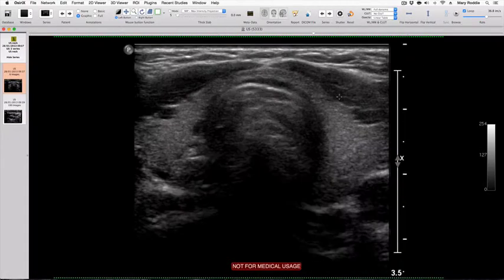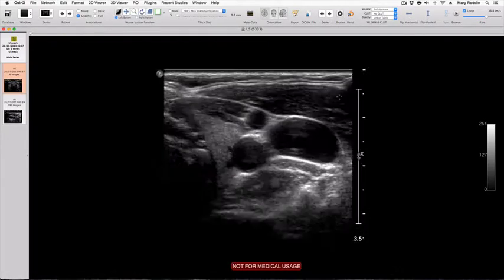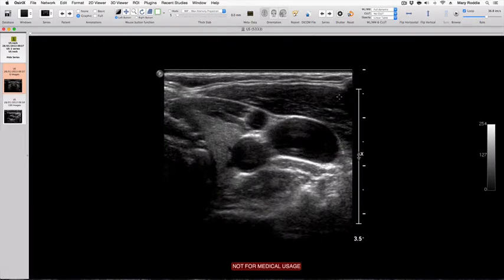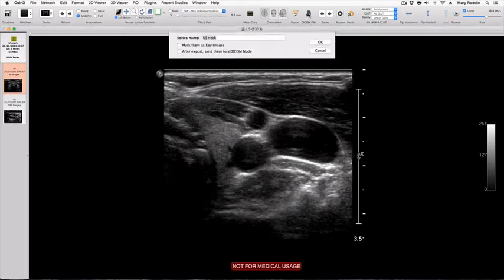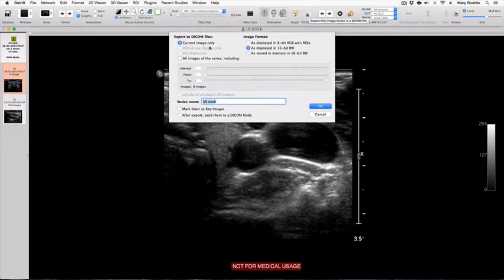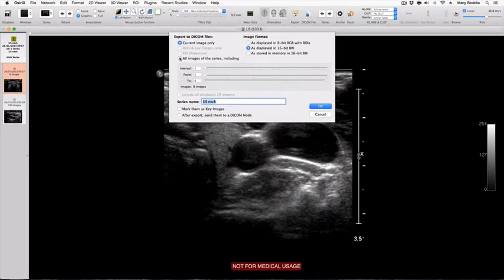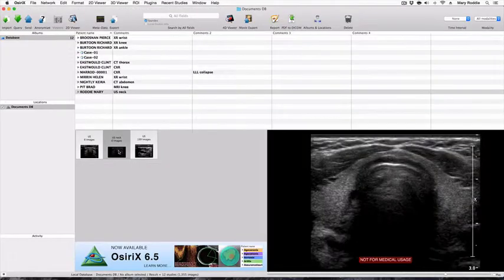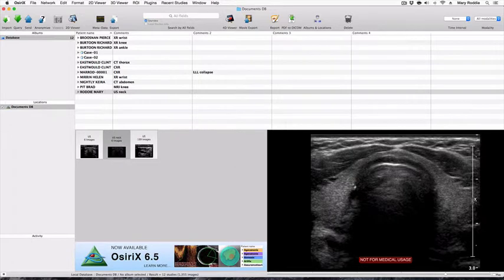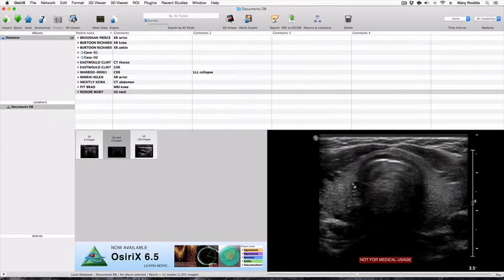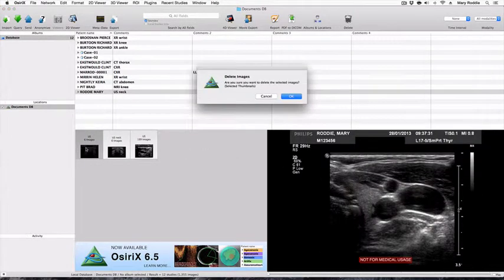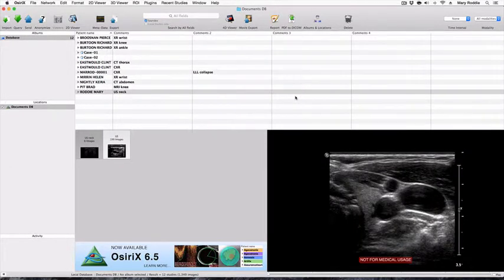You'll notice that this has done this for all images in the series. What we need to do now is export that as a new series, so we go to DICOM file, all images of series, we'll call this ultrasound NEC and press OK. I now have a new anonymized series of images, so can backspace on the first series and delete it.